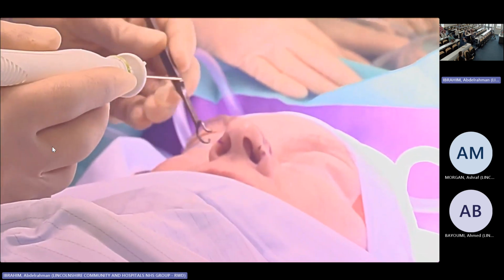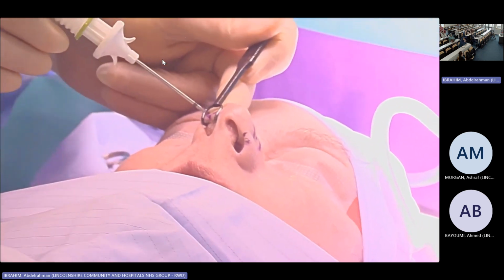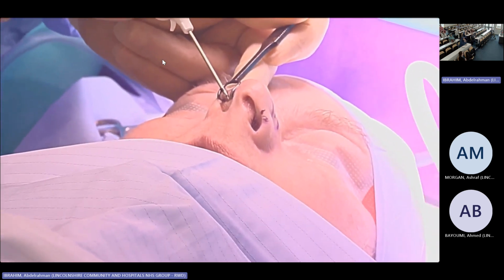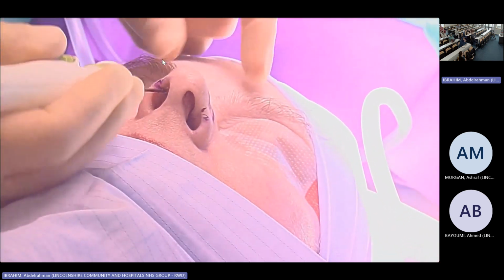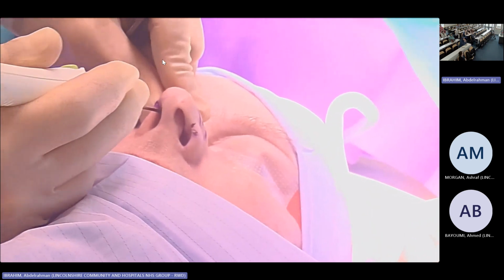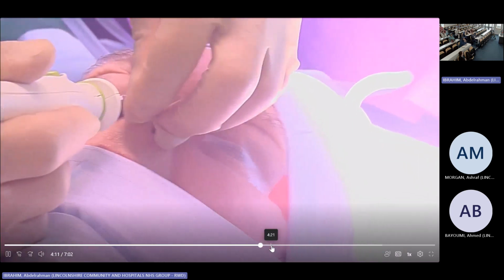And then again, you can see how the valve collapsed in this lady, and you will see after. So the pivots will be towards the skin. Make sure that the pivot is toward the skin there, okay? And it's 90-degree down, and then turn around and up in the direction of the bone and the cartilage. Once you're in, you just release it.